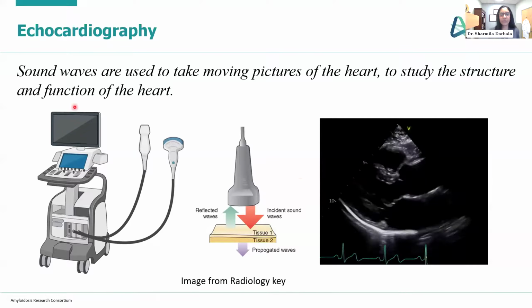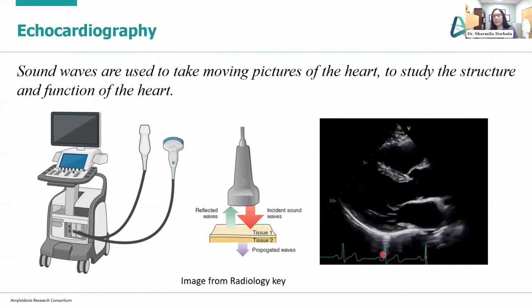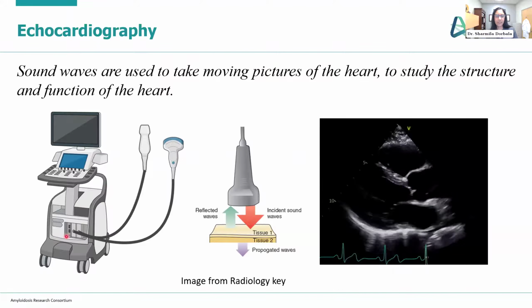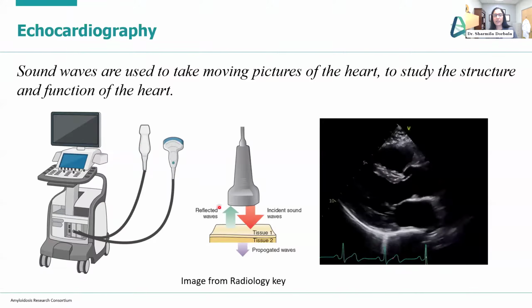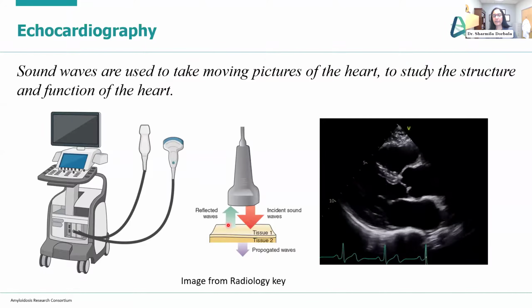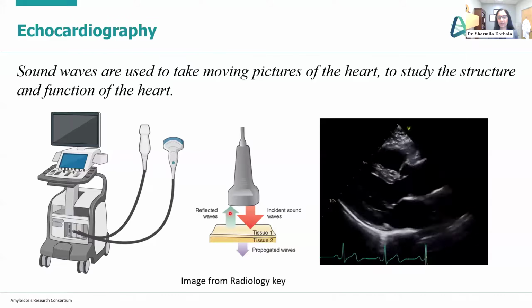So I already introduced this briefly with you. Echocardiography is an ultrasound exam of the heart. And as you can see, this is a painless test. Basically, this is an ultrasound machine. These are the probes. Here we use sound waves. We transmit sound waves from the probe, and we collect the reflected sound waves from the heart or from the kidney or whatever organ you're imaging.